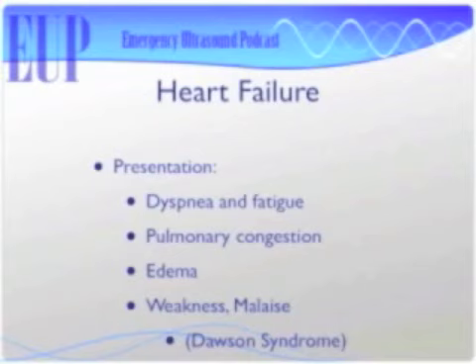So it can be pretty challenging, and it turns out that your physical exam pretty much just sucks. So sensitivity of JVD, 30%.